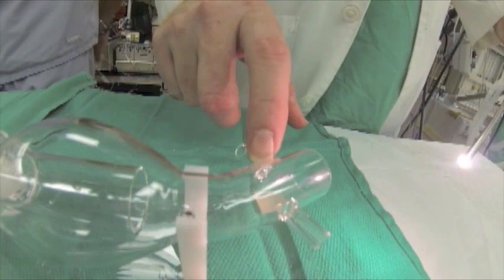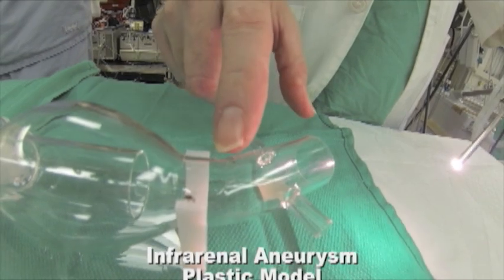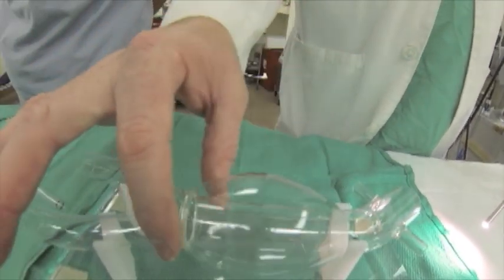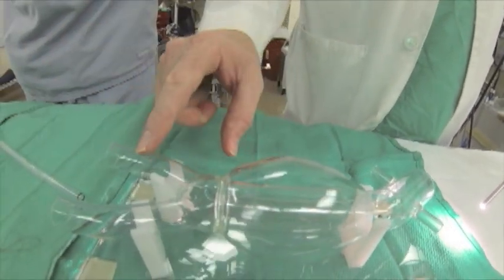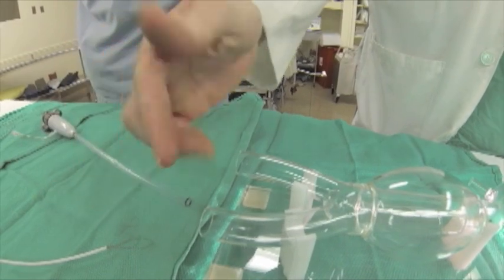This is a case of an Endologics abdominal aortic aneurysm stent graft placement. Here we have a plastic model of an abdominal aortic aneurysm. These are the renal arteries, this is the aneurysm sac, and these are the iliac arteries.